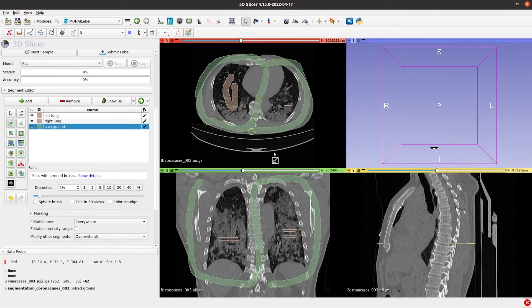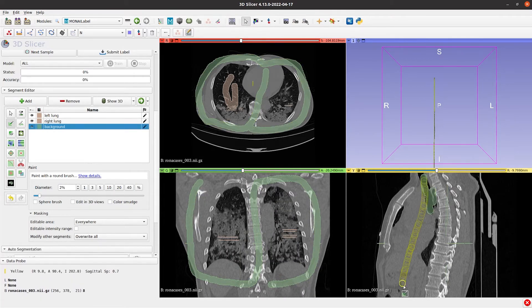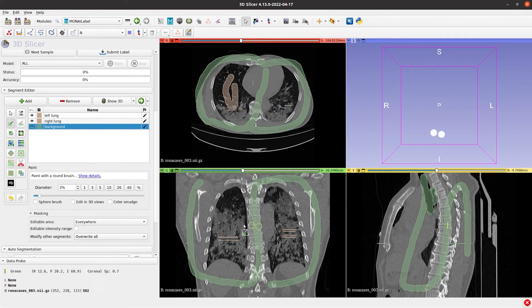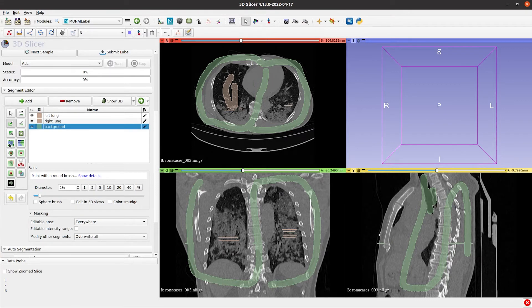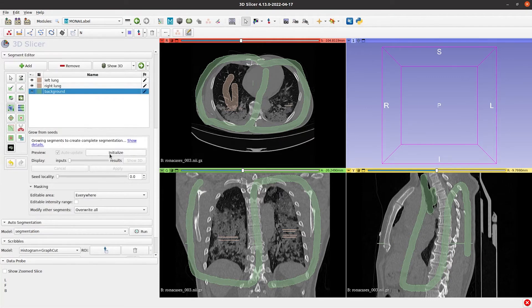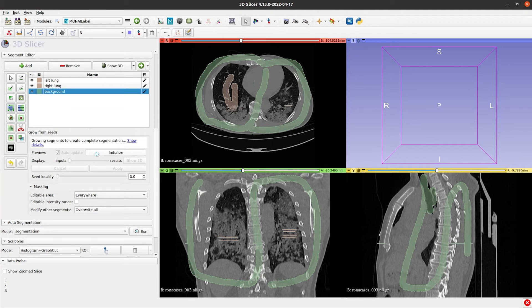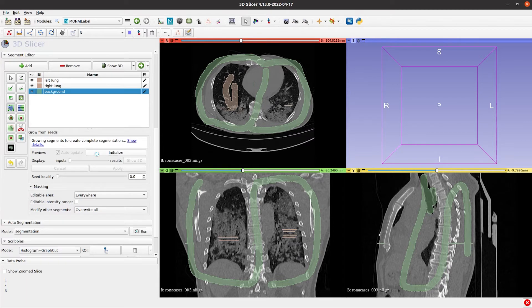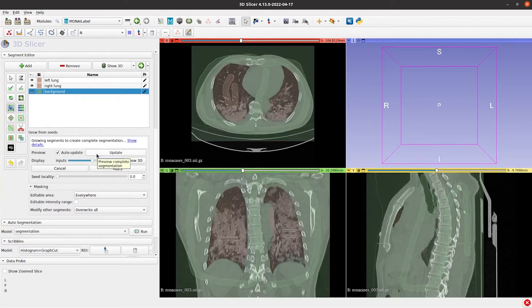Once we add the Seeds for all segments, including the background, the next step is to activate the Grow from Seeds functionality and initialize. This can take 30 seconds to a minute depending on the image and organ size, and of course, the computer you are using.